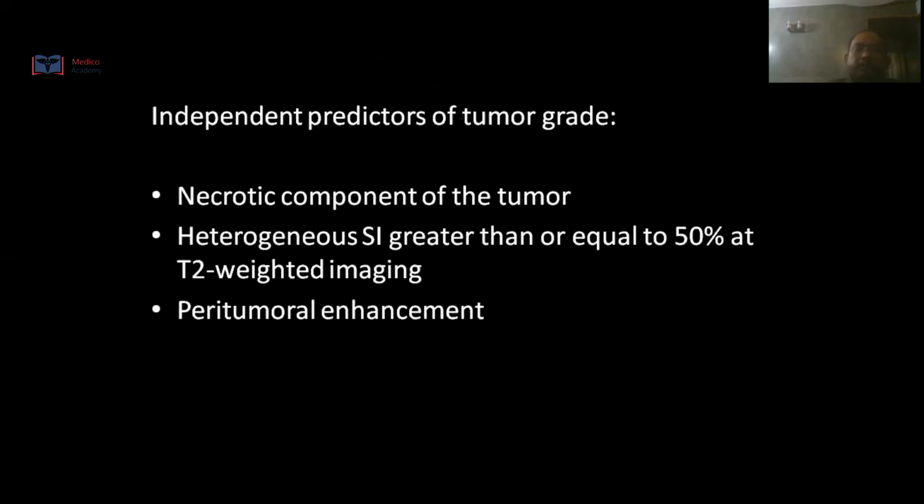There are some independent predictors of the tumor grade, such as the necrotic component of the tumor, heterogeneous signal intensity greater than or equal to 50% of the T2 weighted image, and peritumoral enhancement.